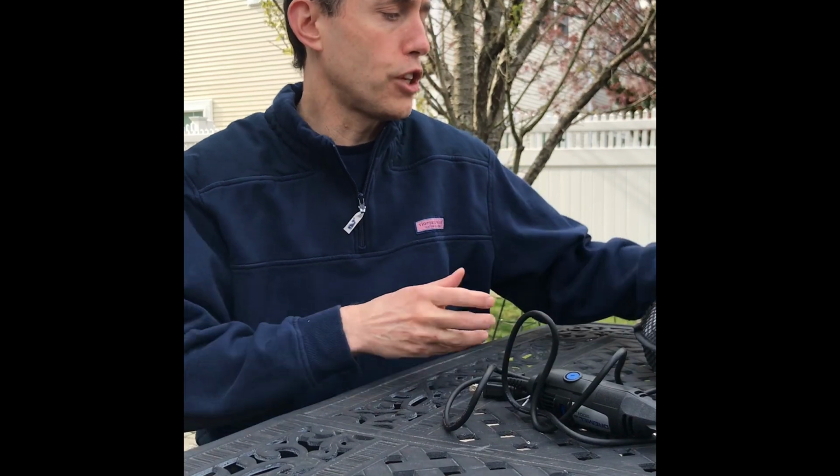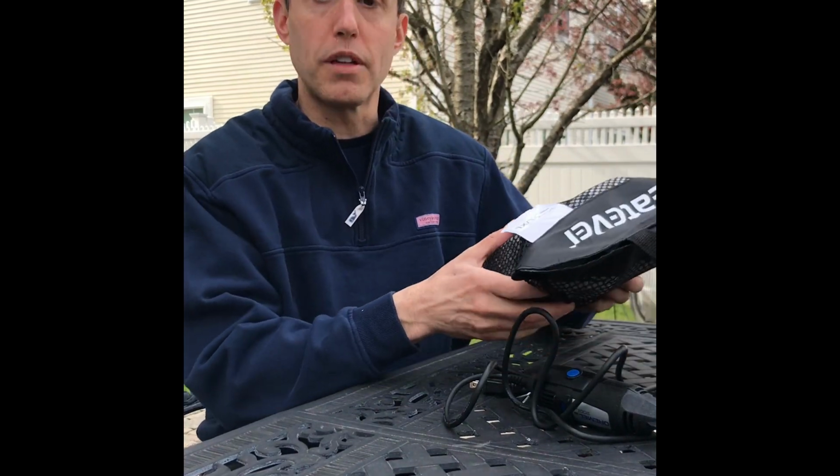So the question is, can we make something more effective against the droplets of COVID, and COVID apparently can sometimes be aerosolized as well? Is there something that is even more effective than an N95 mask? Well, today I'm going to show you the full face snorkel mask.